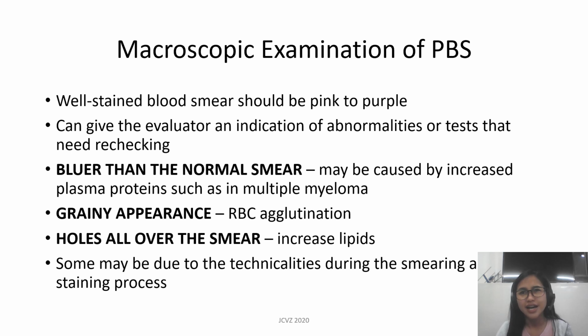Or if it's a non-pathological cause, it could be due to technicalities during the smearing and staining process. Probably your slide or the spreader is not clean, and that could create holes in your smear.